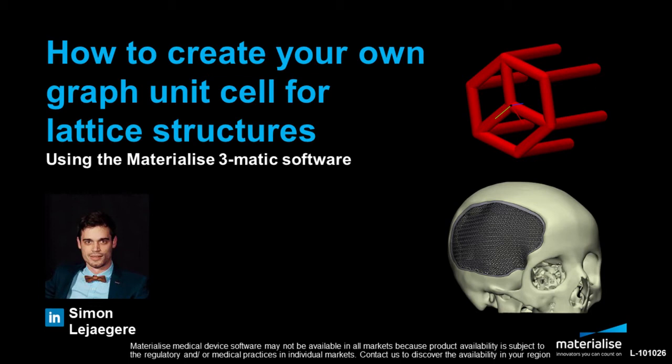In this video I will cover two methods to create your own graph unit cell, one starting from a base primitive shape and the other starting from an imported curve model in IGES format.